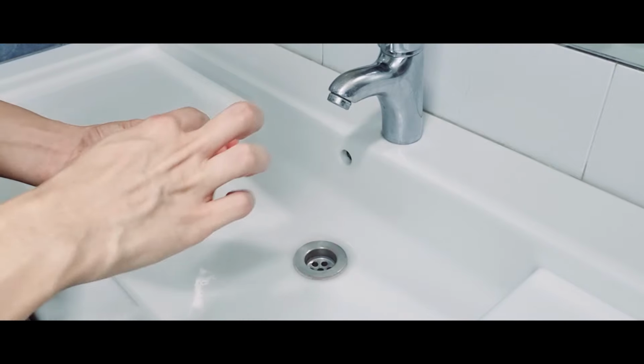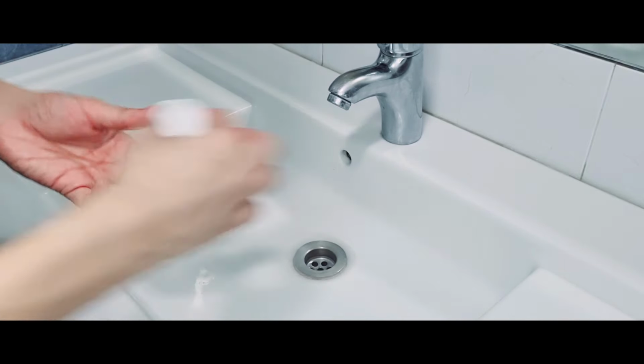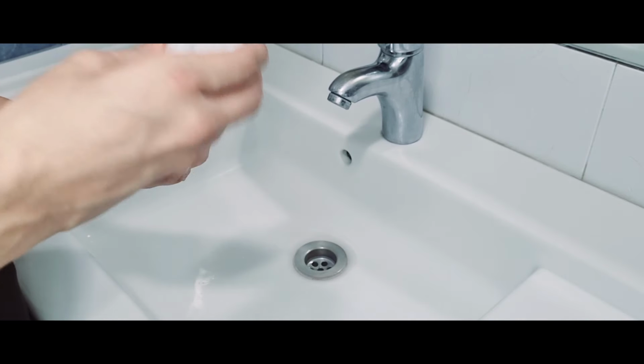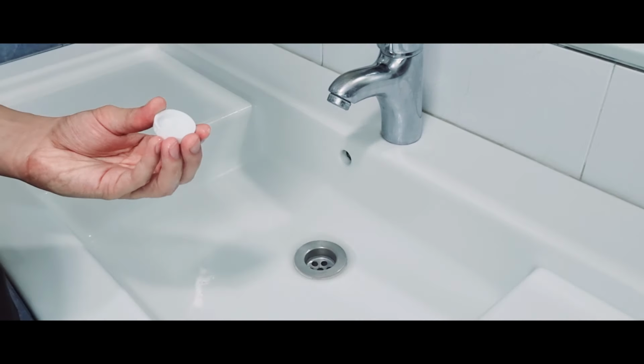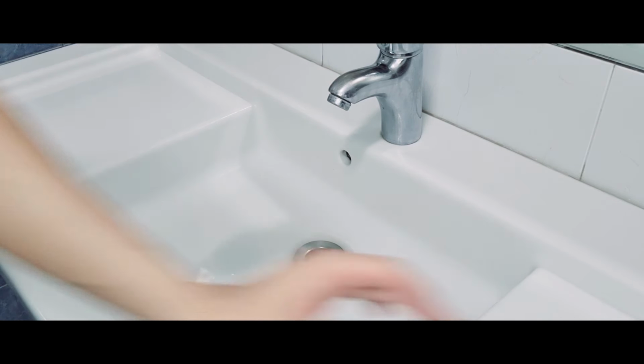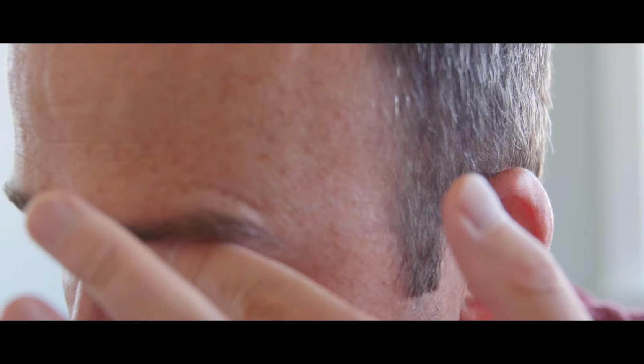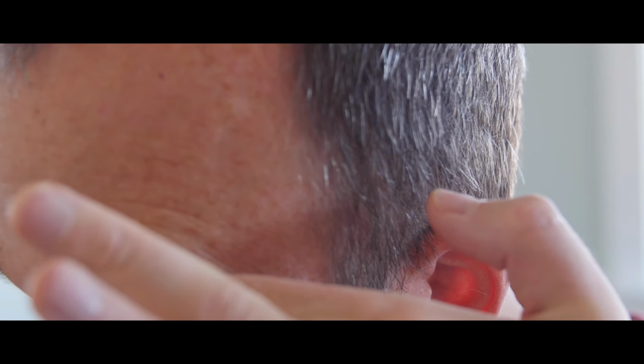Whenever you remove your contact lens, make sure to put some solution inside the case and just rub it with your clean finger and get rid of all the protein, all the dirt that is inside the case. That is really important. And make sure to change the case every 1 month. Most of the new solution, if you buy a bottle, you will get a free case with the bottle. So make sure to change the case every single month or after every 40 days. I think that habit is really important.